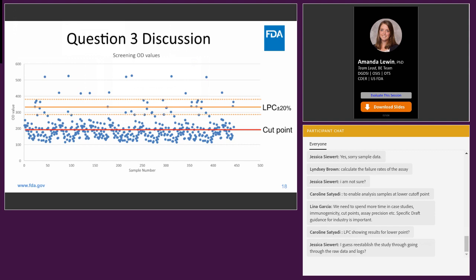When samples go through screening, confirmatory, and maybe even also titer, that's actually 3 sets of the same sample being analyzed in the screening assay. And you can look at the results of that and see if your screening assay, especially in those samples near the cut point, is reproducible. And that might be something that can help justify the data set, even though your LPC in this case wasn't so great. So just one more example here.